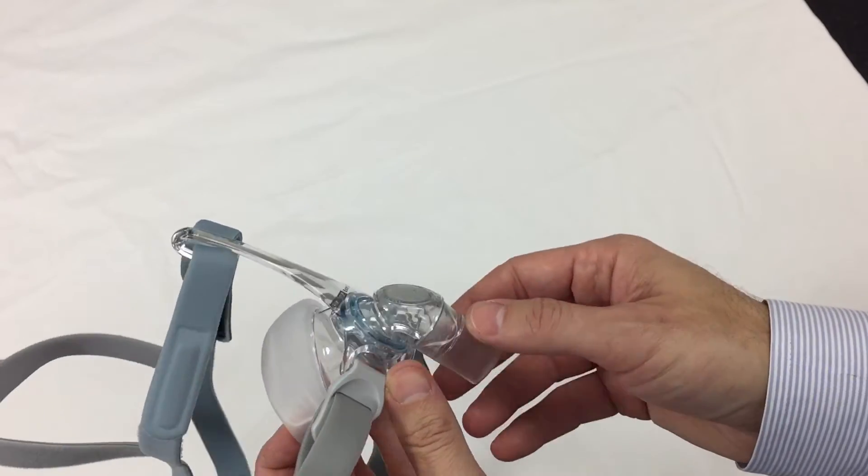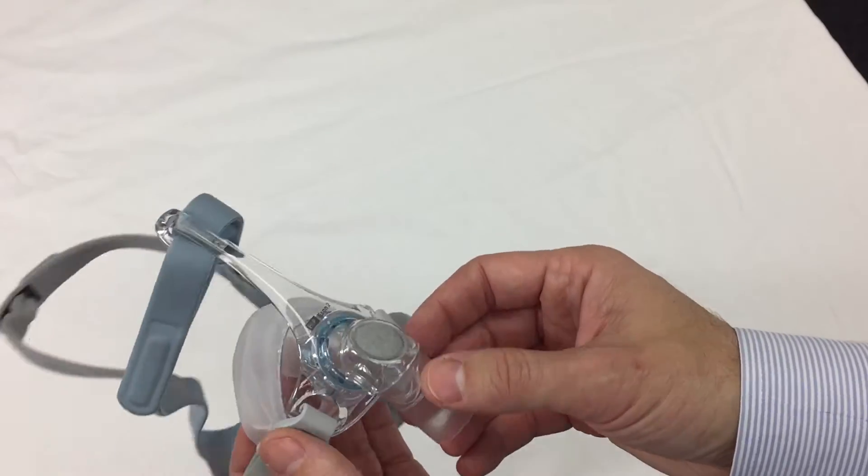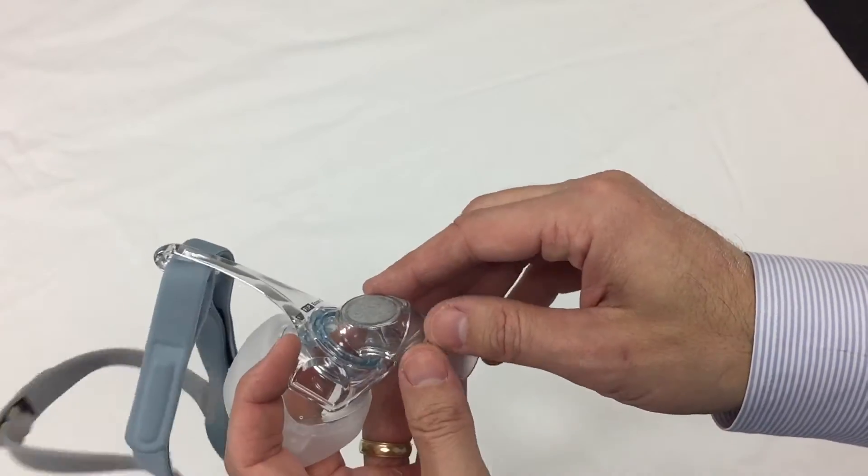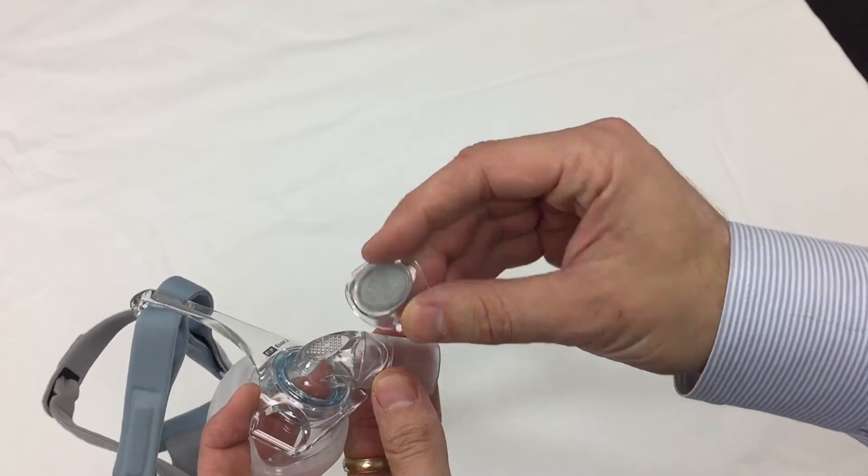And that swivels all the way around. It has a lot of margin of error to it. This is a new mask filter. The previous Isan, you had to throw them away.